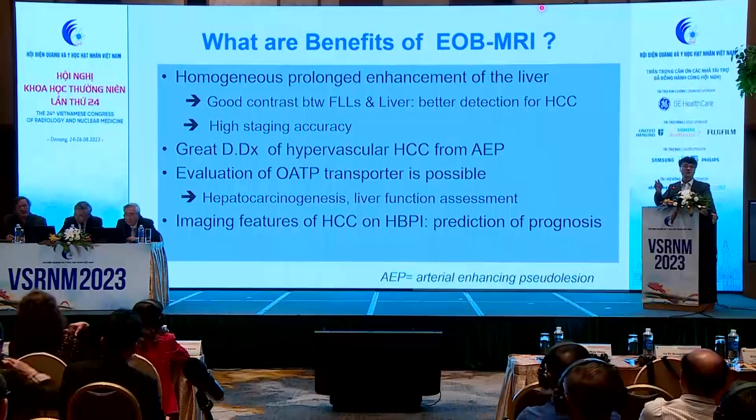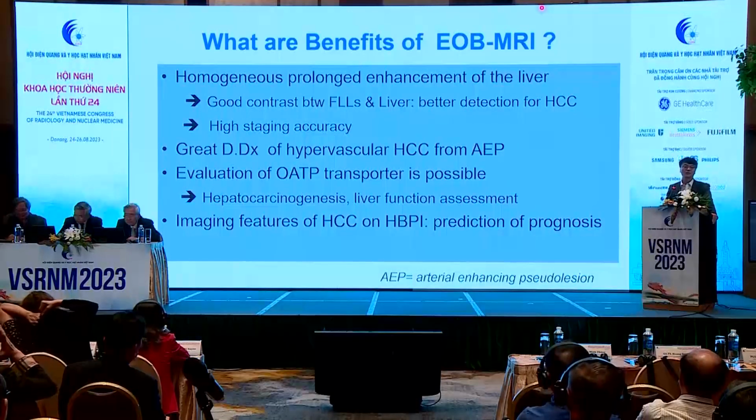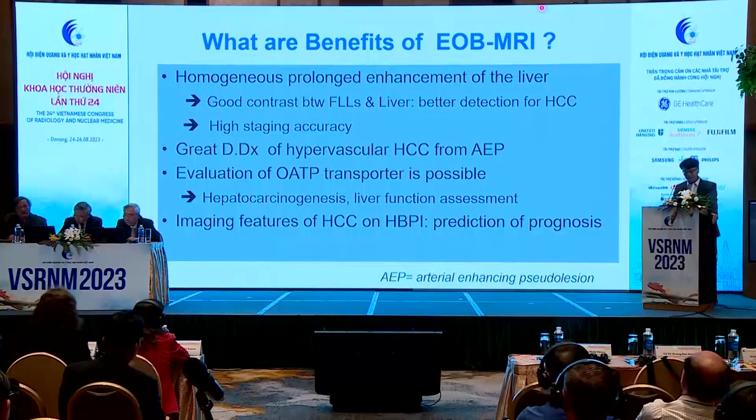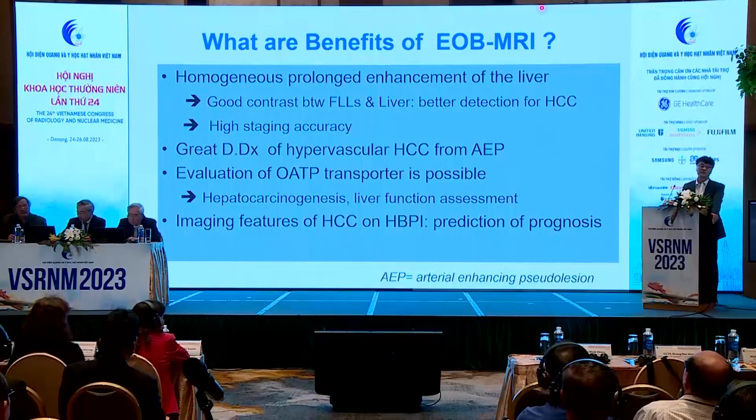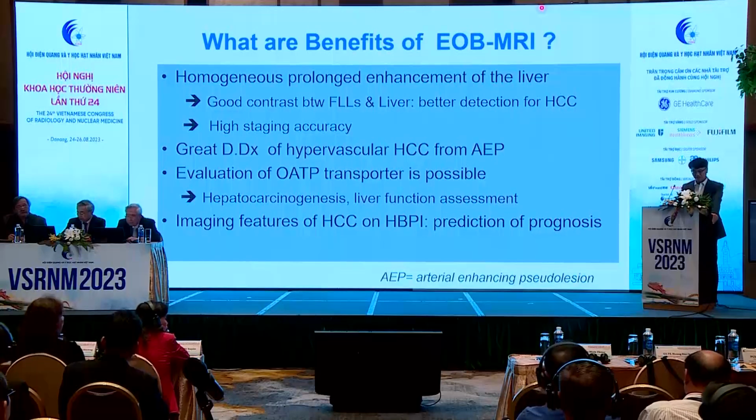On the contrary, focal liver lesions show hypoenhancement. Therefore, we can have a very good contrast between focal liver lesions and the liver background. So we can have very high staging accuracy.